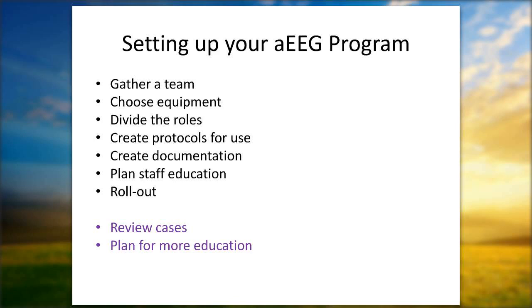So I think it's not a short-term process setting up an aEEG program. I've worked with some units over several years as they've rolled this out, and even the places around the world that have been using aEEG for decades, literally for decades, they still have to review these very simple things all the time. Continuing to just assess where you are and how you're using the device will really serve you well and will help you to serve your babies even better.